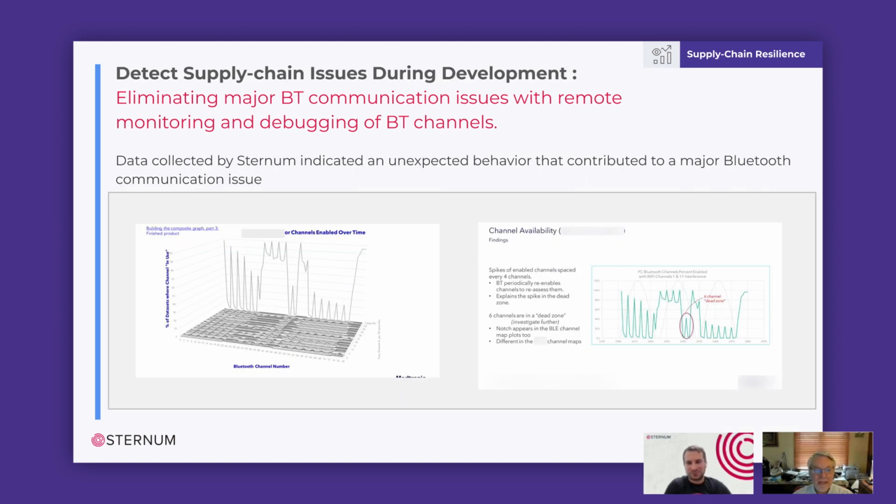Okay. Now here, I don't know how familiar the audience is with Bluetooth, but we're using Bluetooth Classic, a serial port profile to communicate between our instruments and an iPad. And Bluetooth has 79 channels that it hops between, that spread across the same spectrum that's used for Wi-Fi. And so those channels can be adaptively mapped out if there's too much interference in that particular slice of the frequency band. And so one measure of quality of your Bluetooth connection is how many channels are usable. And Bluetooth has an algorithm for mapping in and out channels to adapt to the noise in the environment. And you can read that channel map from the Bluetooth hardware and see which channels are actually in use.